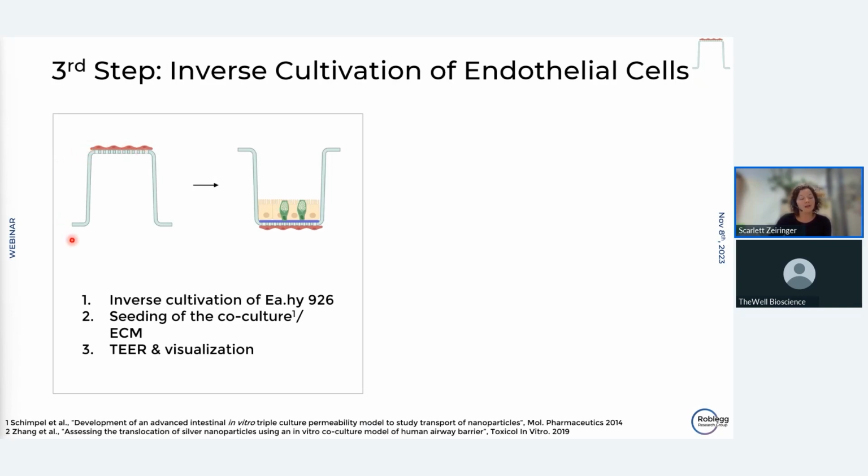After 2 hours of incubation, the insert was placed back in the original plate, which allowed adding the VitroGel hydrogel system and the co-culture of Caco-2 and the goblet cells. This system was cultivated for 7 days, followed by the characterization via TEER measurements and visualization using histochemical investigations.